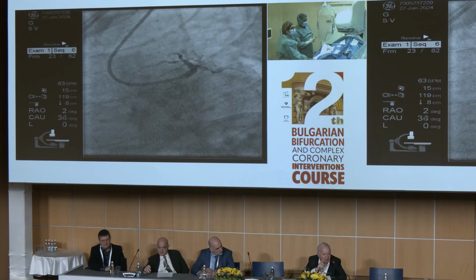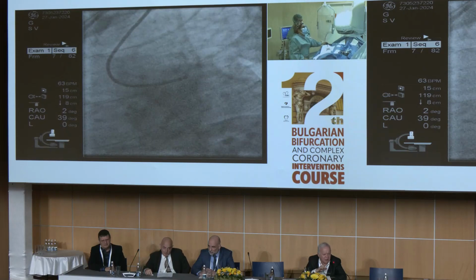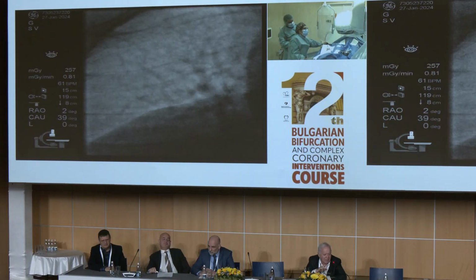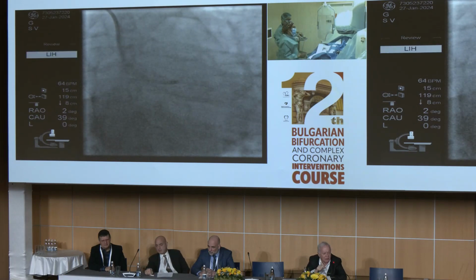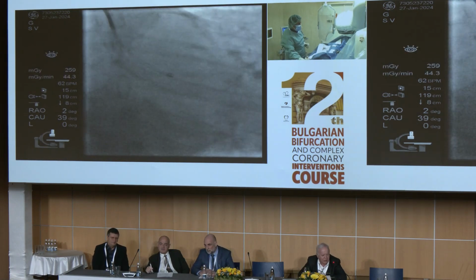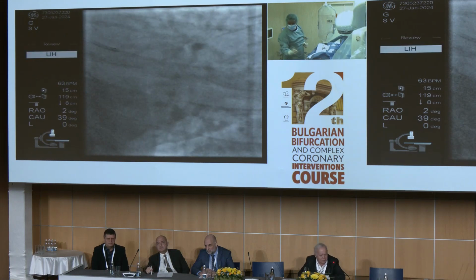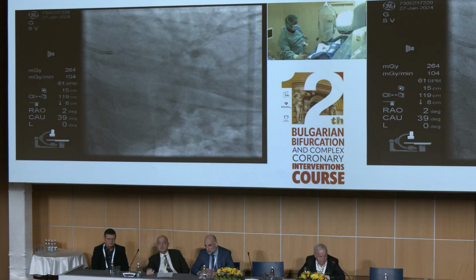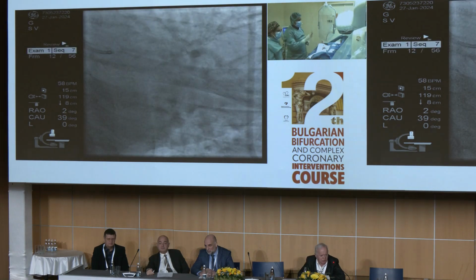Except if the proximal segment of the LAD is no longer than 8, for example. Because when you do a bifurcation, you need room to do a POT in a crossover stent. So we need at least a measurement of the proximal segment of the LAD. Let's film here. Yeah, and once again. Okay, it's nice. Here the proximal part looks good.